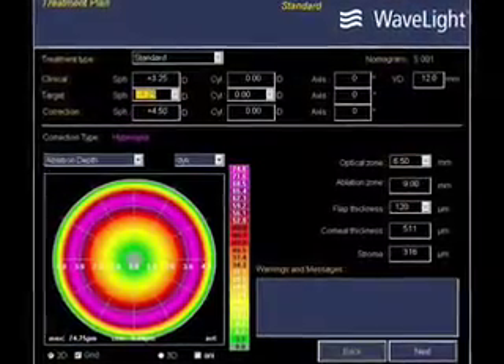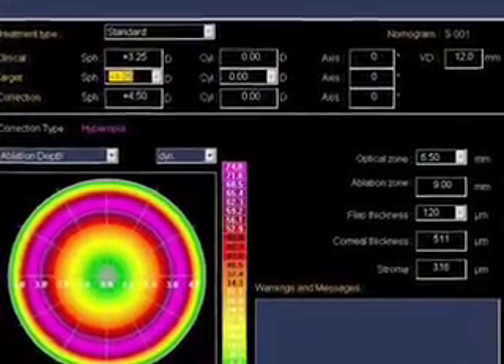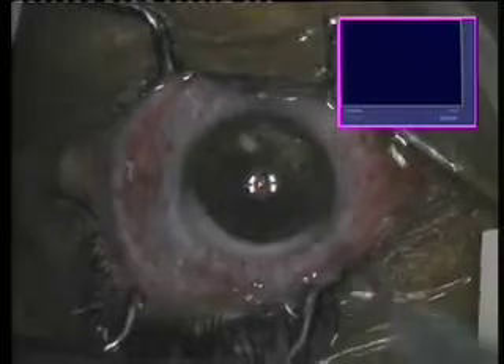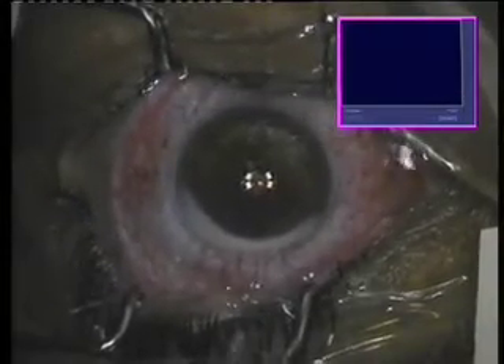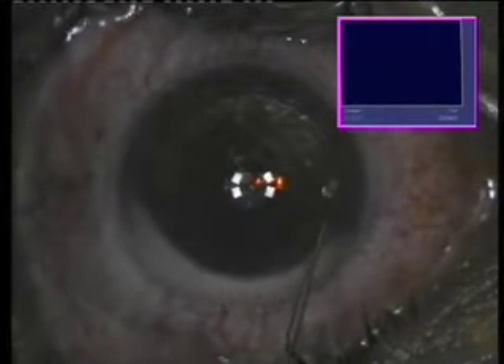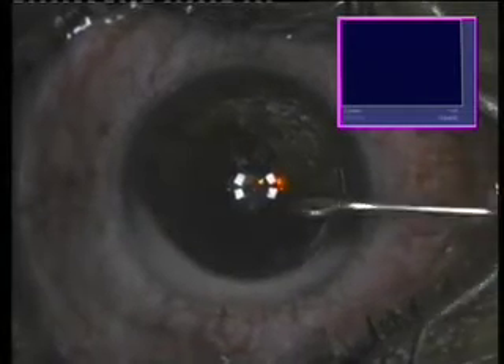The flap is completed within seconds. The peripheral cut is seen here. Again, this flap is a superiorly hinged flap. We're going to see here the treatment plan, which is clearly centered into the pupillary center. It's a hyperopic correction of plus 4.5 diopters, no cylinder. We'll rinse off the surface. This is the left eye of the same patient. A drop of antibiotic before we lift the flap. This flap now is centered over the central part of the pupil. This is the non-dominant eye, and this patient is part of a study comparing topography-guided versus standard hyperopic treatments.